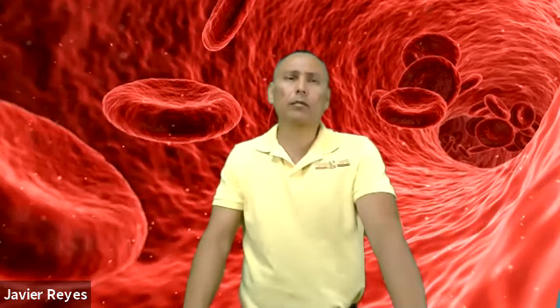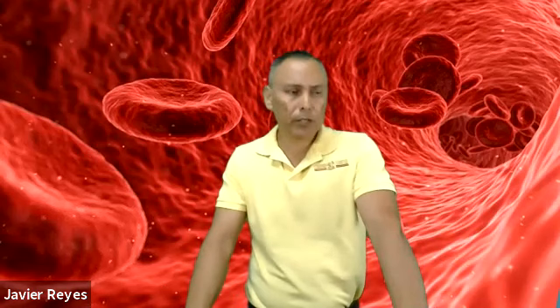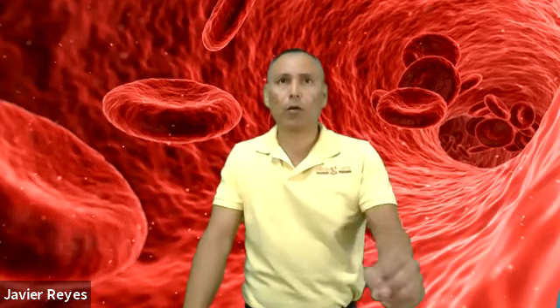The tourniquet being too tight or too close to the site could also cause the veins to collapse. If the tourniquet is removed during the draw, it might completely stop the blood flow. Again, we can leave the tourniquet on until the last tube. If the person has a very slow blood flow, you can leave it there, especially with the elderly people.